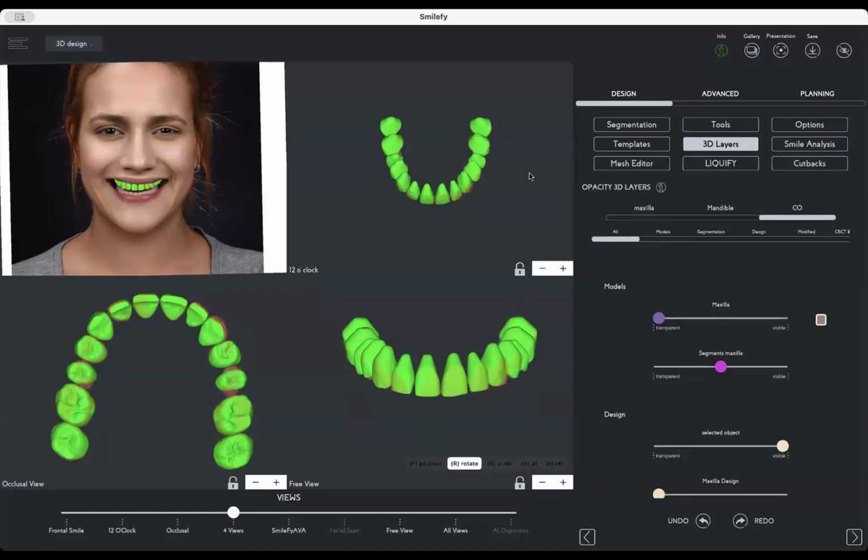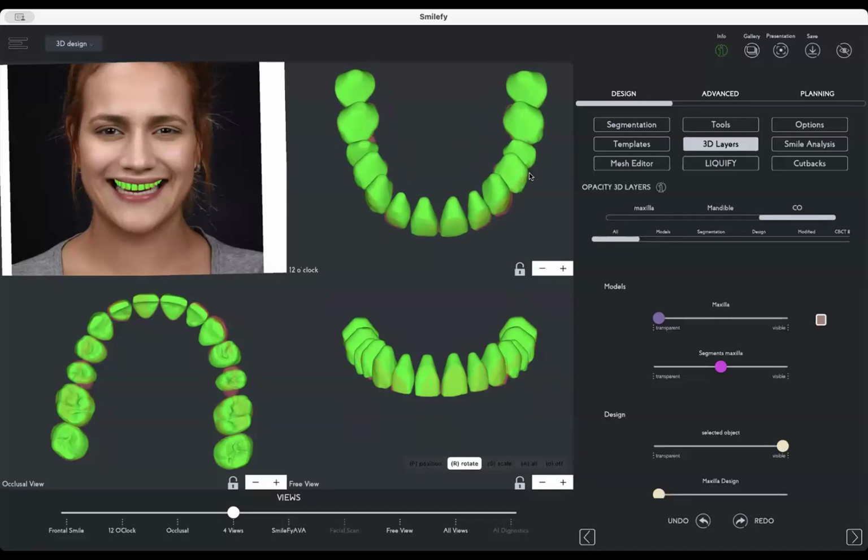It's a very small one. You see, it's nothing big, nothing crazy. But if we bring your teeth in the correct position in an ideal occlusal curve, we can create your aesthetic treatment in a way more stable way, number one.